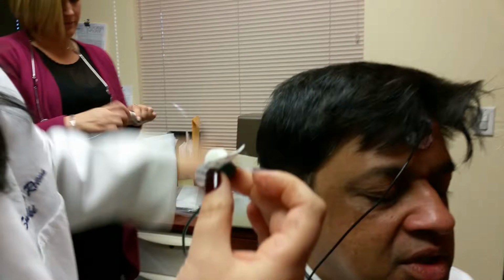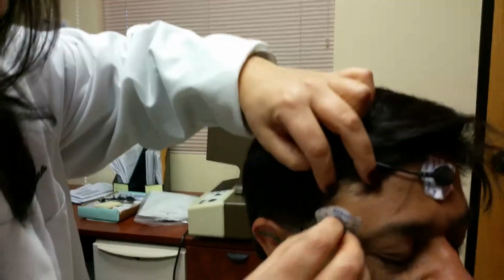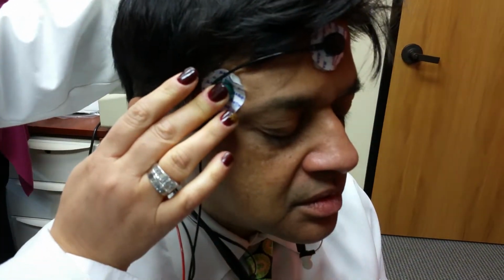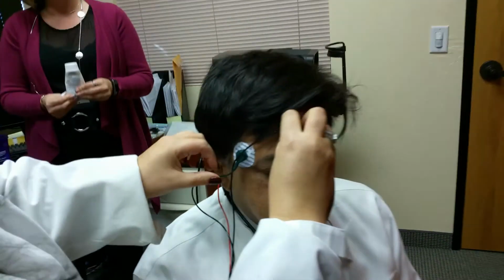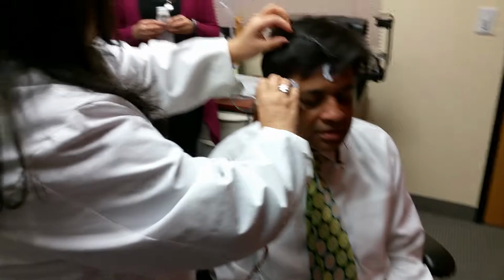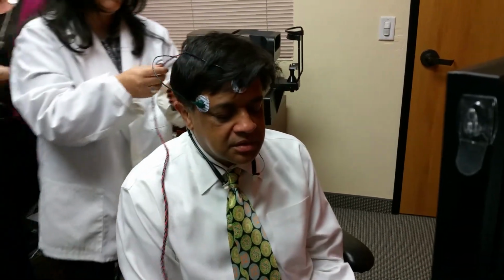It's amazing that a multifocal would have that impact. I used to have a file with me, and I don't have it anymore because I got rid of that flash drive. I think I accidentally deleted it. There was a patient that we tested one time in one of the practices that I was in, and her test results were terrible. Amplitude was low, latencies were late, everything was red, and the doctor was like, oh my gosh, we need to start treating this patient.